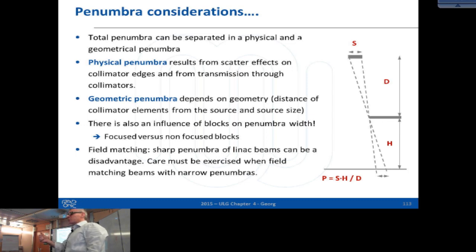Then the cobalt sources need to be put somewhere in a radioactive waste place. Then all these companies needed to have the license to transport the sources. I'm not allowed to. You've heard something about the ruthenium applicators. We have beta-emitting sources that are used in brachytherapy to treat eye lesions. And this is beta ruthenium-106. It's a small applicator like this, and it's in a lead container, maybe double the size of this bottle. So I can take it in my car and transport it somewhere, but I don't have the license to transport a radioactive source. So all these things, of course, also play a role when dealing with these sources.